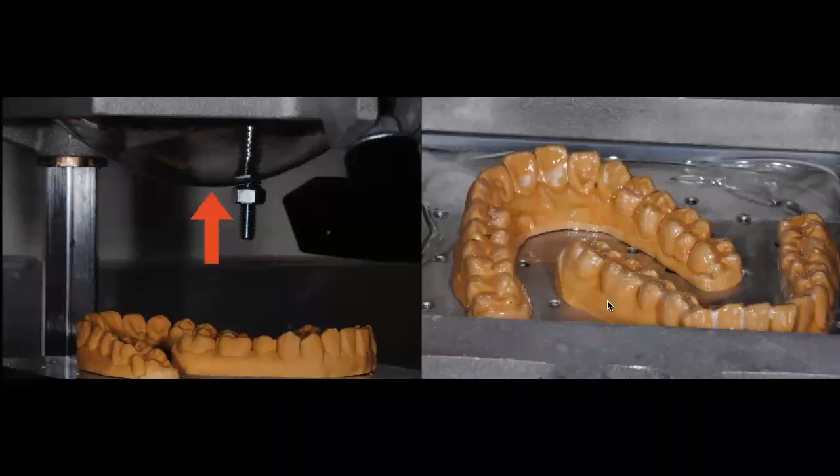If these models are not touching, you can see how well adapted the tray becomes. It's so soft that it becomes very well adapted around both models using only one tray. So trim the models correctly, making sure they're not tall, because you don't want any retentive features on these models. You want to be able to remove these trays as quickly and easily as possible without damaging the tray.